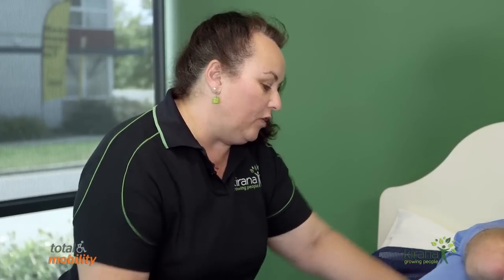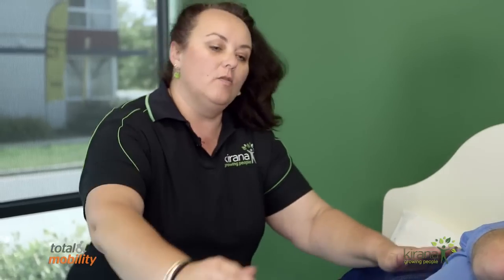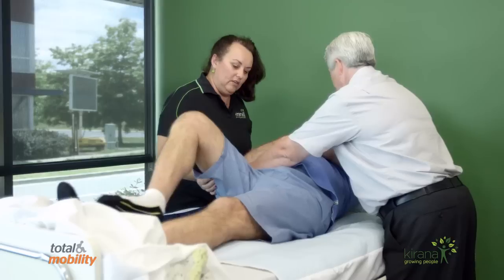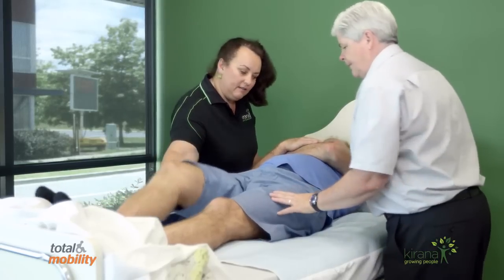We're using a head support sling, so the top of the sling should be at the crown of your head, and the apex on the top of the curve of the sling should be at your tailbone. Mr. Williams, when you roll over you'll feel a bump — that's the sling. We're going to count to three and bring you back towards me — one, two, three, roll towards me. Thank you, you can lower that leg now. So now we need to roll you towards me — just going to roll you to Melissa to get the rest of the sling through.